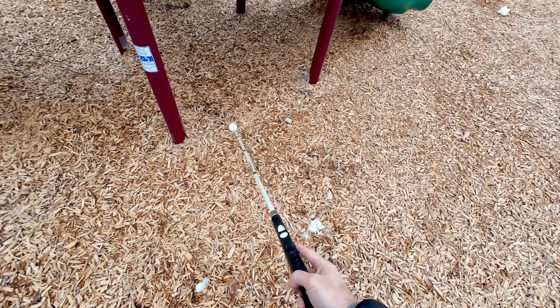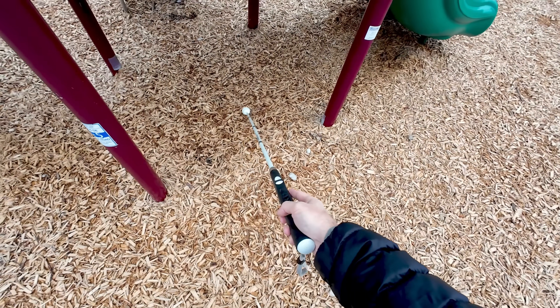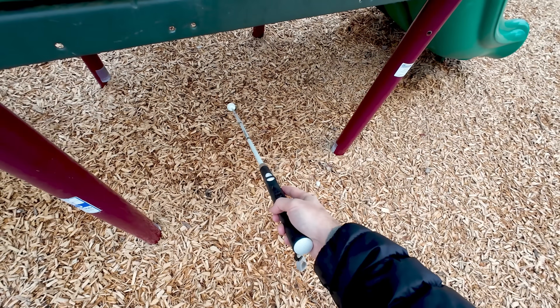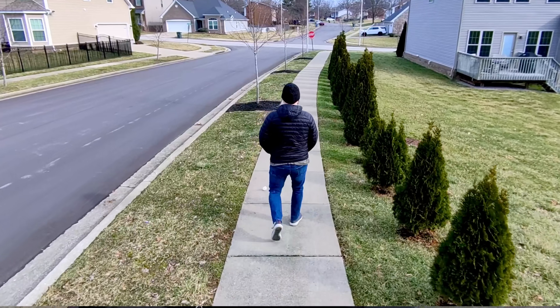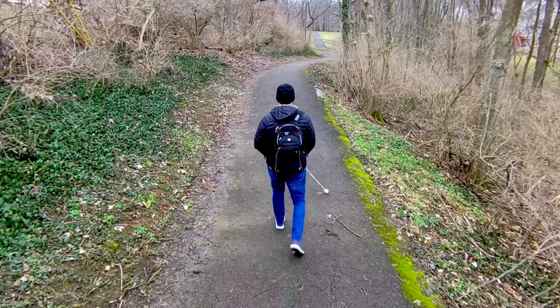And that, my friends, is how obstacle detection works with the WeWalk Cane. I was showing you with the audio alert, but you can also turn on vibrations if you don't want that beeping. In that situation, the cane will vibrate to indicate that something is in front of you.